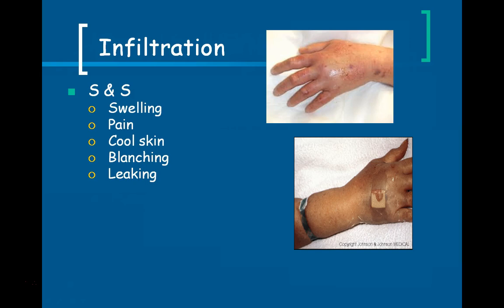One of the things with infiltration, if the patient has been sitting or laying in one position and you go in and they're reporting that it hurts and you look at it and it looks fine, make sure and pick their hand up or pick the arm up, because sometimes the fluid goes to a dependent area and you may not see it unless you pick the arm up. So make sure and look carefully.